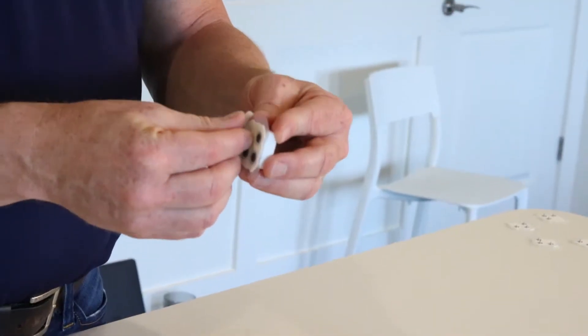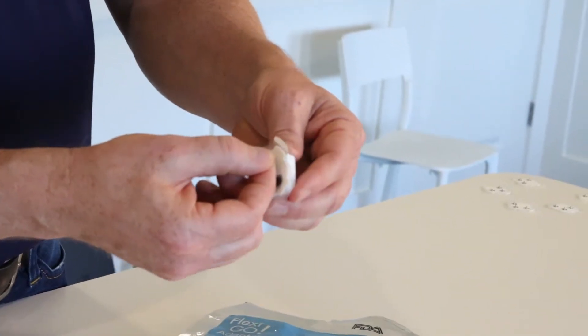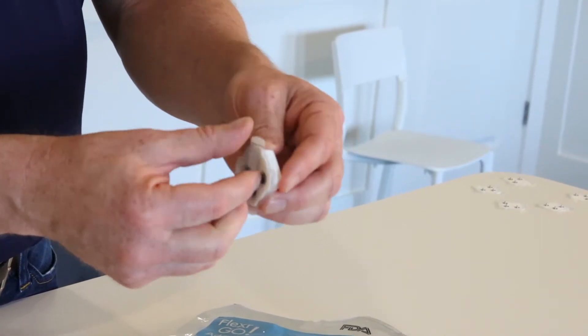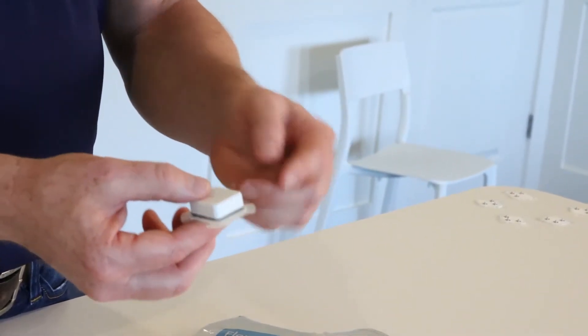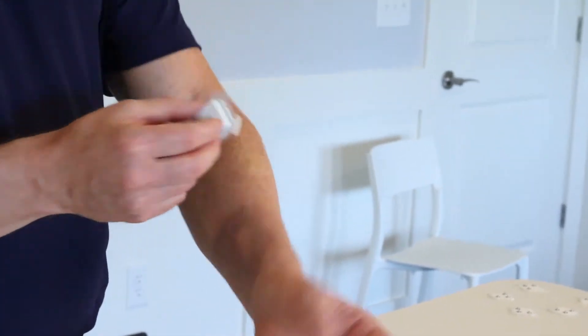When I get ready to begin the treatment session, I simply separate the plastic backing from the gel electrode. At that point, I'm ready to stick this onto the skin.